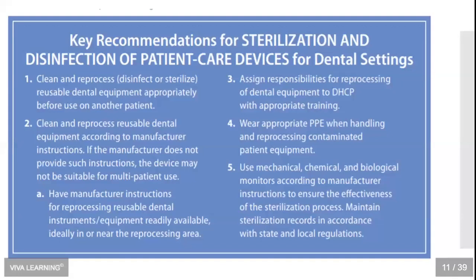Keep in mind, if your facility is in an institution type of setting, a hospital setting, a learning center such as a general practice residency program, a hygiene training program, an assisting training program, you may be required to validate your cleaning process as well.